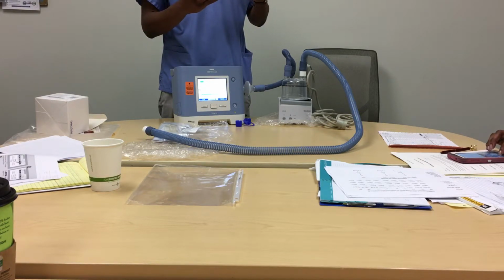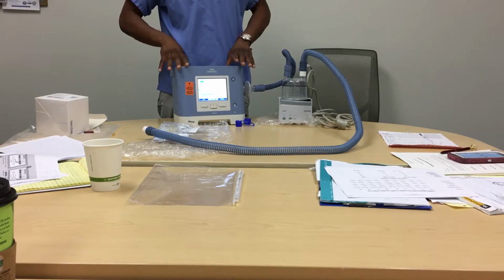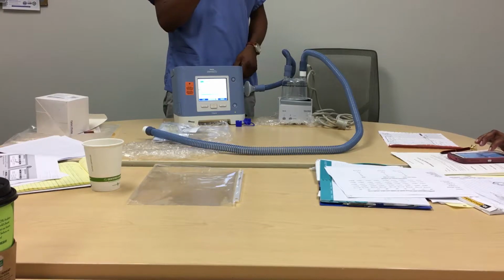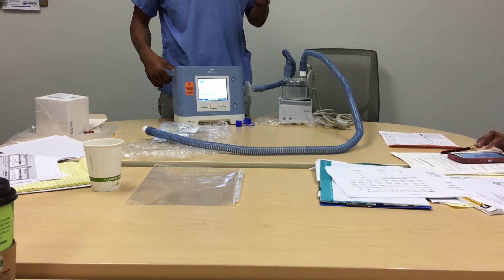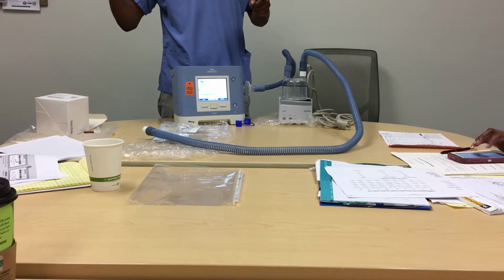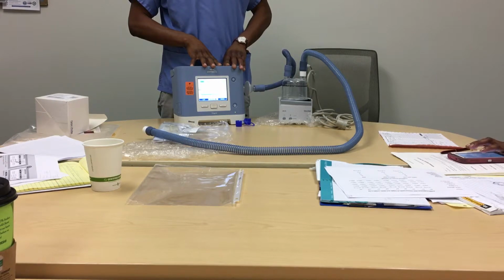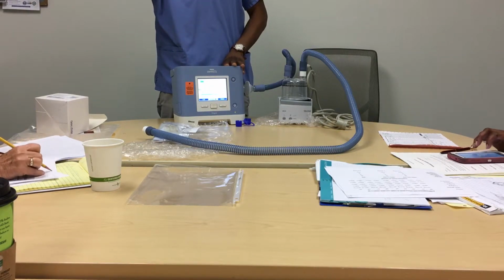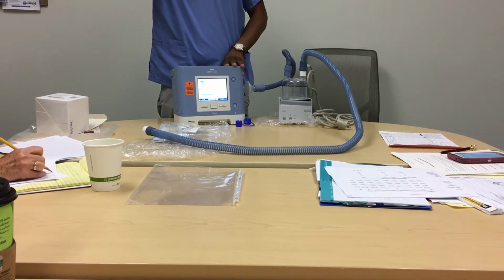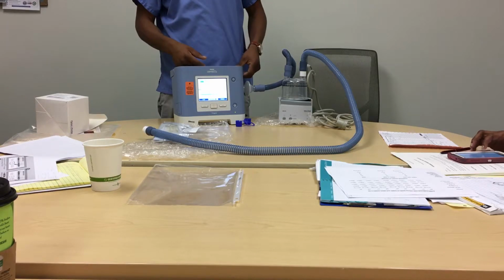Then we noticed changes. Now speaking to the ASV, there are two things I've noticed. With patients that are on the ASV on the regular Respironics BiPAP, and they are neuromuscular, it usually works for them better than the ResMed ASVs. Because with the Respironics ASVs, it has a max pressure and a rate. For the ResMeds, it just has a minimum EPAP and maximum IPAP, so there's no dial-in rate. If they are the kind that just ride the vent, it will not work for them.